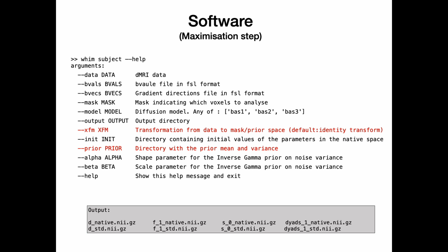The input is the subject's diffusion MRI data together with transformation to a common anatomical space. It can also accept a fixel template. The output is the estimated fiber-specific parameters for that subject. The subject-level results are then used as input for the group-level analysis. For this step, we strongly recommend using a multi-modal registration that includes diffusion data in the registration process, since conventional structural images do not provide sufficient contrast for accurate alignment of deep white matter. A good registration option within FSL is MMORF, which is well suited for this purpose.